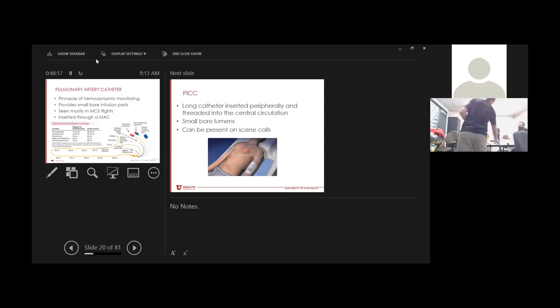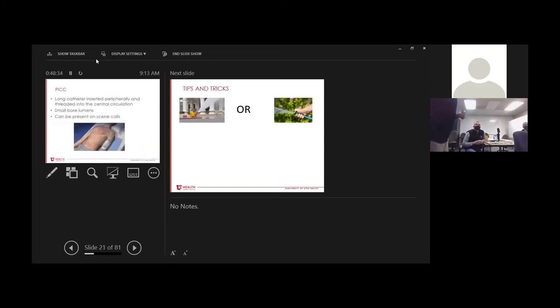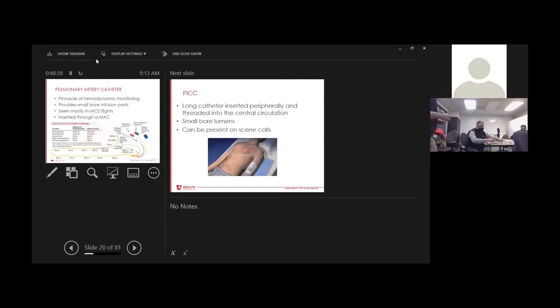But most of the time, good eye. On this one it's being different. It should look like this, right? Yes, sir. It's got the double lock. I have a question about pressure bagging on these. Absolutely. Again, your flow rate is going to be much reduced once there's one in there, but you can pressure bag.